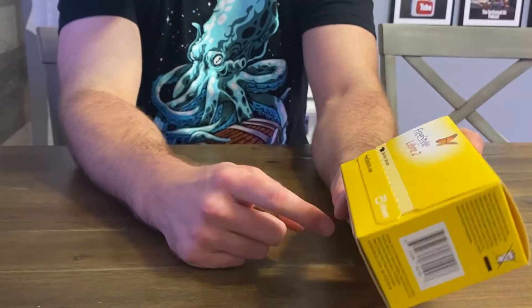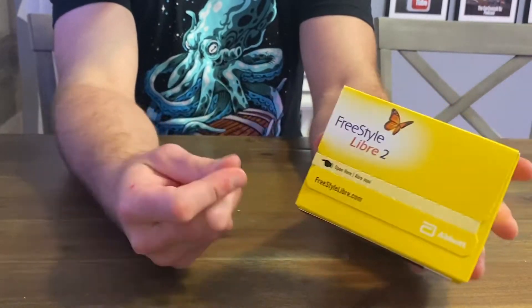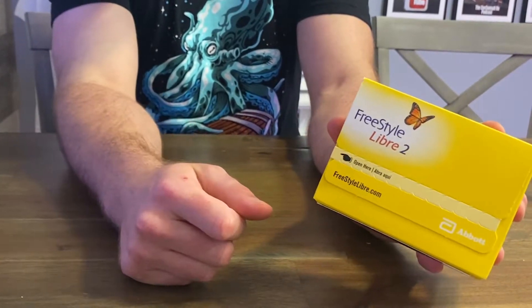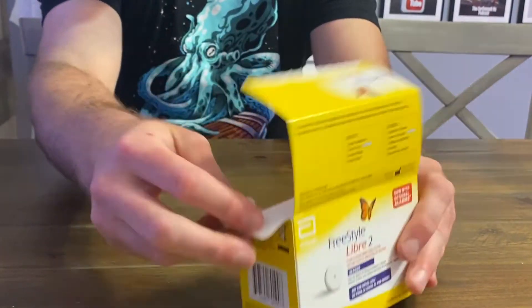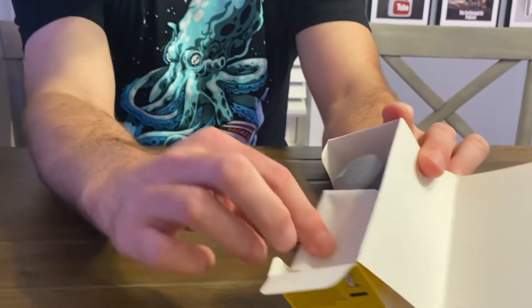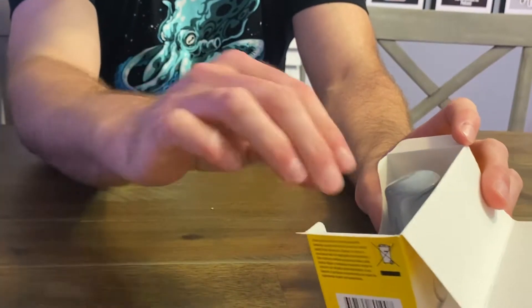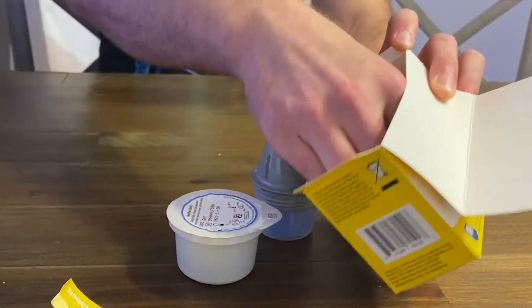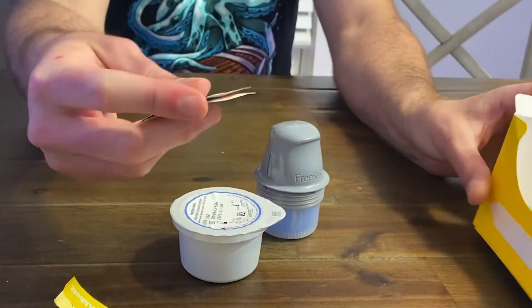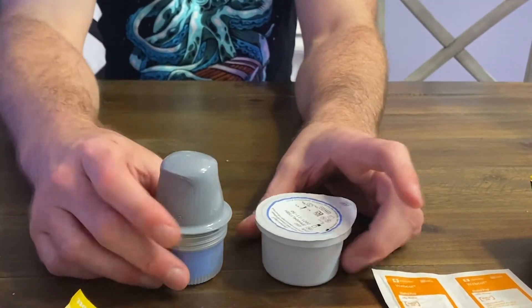The sensor itself lasts for 14 days and each set comes with a couple of alcohol swabs and an applicator. You open the box up and there's a package insert and some directions in there, but we're going to use this video instead of the directions obviously.